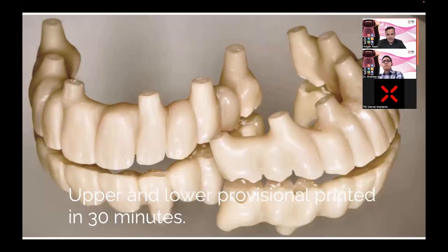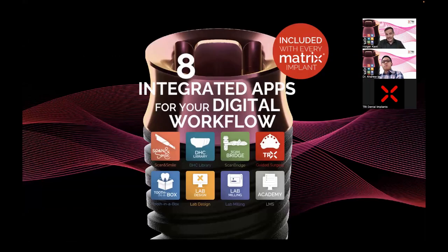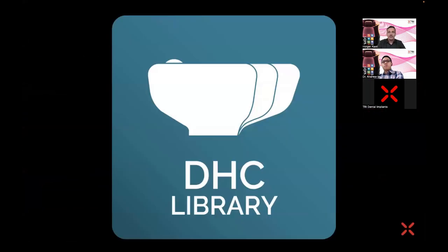This is also possible for full arch restorations. All these full arch restorations are more in the QR code I'm going to share with you at the end. You can do a full arch upper and lower jaw, also 3D printed in 30 minutes, and you get the patient out with an upper and lower jaw chairside in 30 minutes. That's the first app I wanted to talk about.